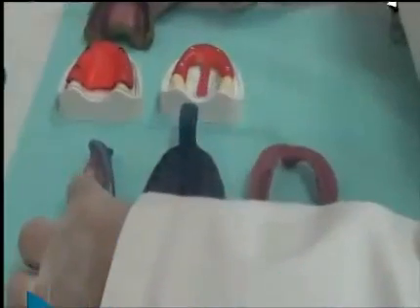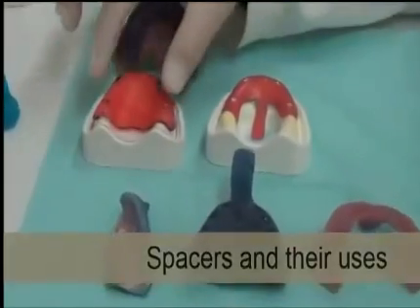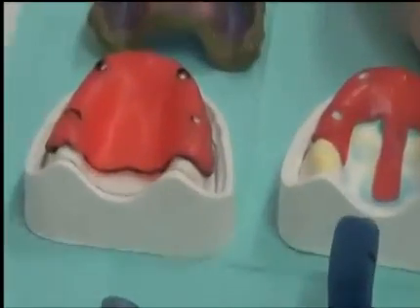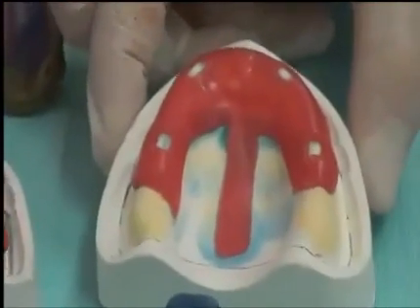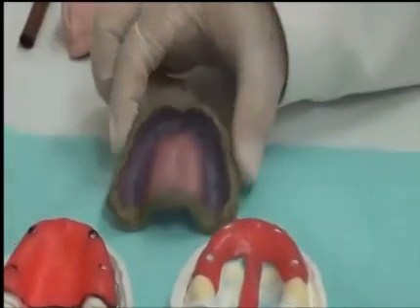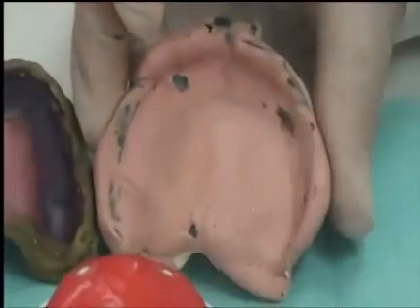The trays that have a spacer, some of them have a complete spacer following all of the tray outline from the inside, or a partial spacer. Remember that at the clinical step, we're going to remove the spacer once we take the impression. So the impression is not taken with the wax inside.